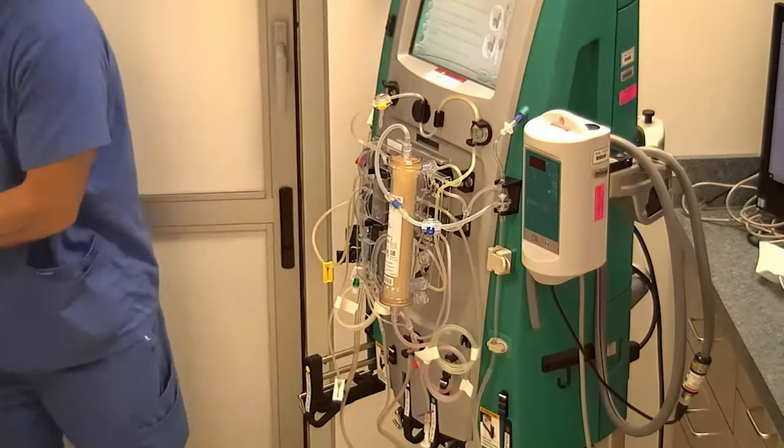There's a barcode reader behind the tubing set here, and it's reading the barcode on the tubing itself to confirm that we have an M150 on our machine. And typically, you are always going to have an M150 for your patients. And it says confirm set loaded, we have an M150.